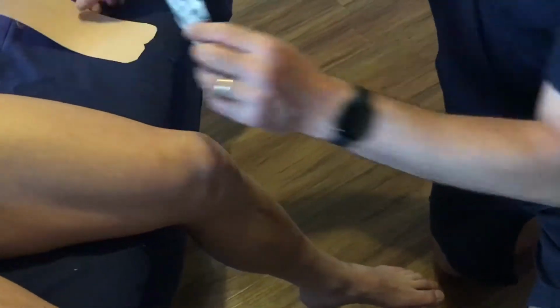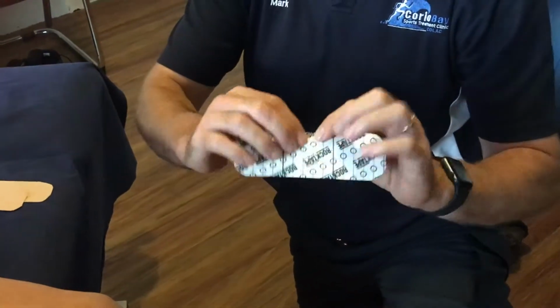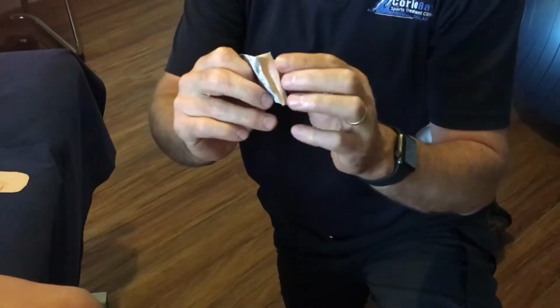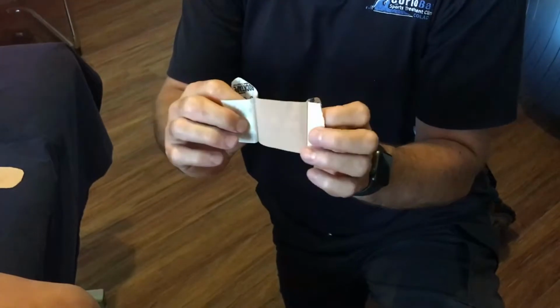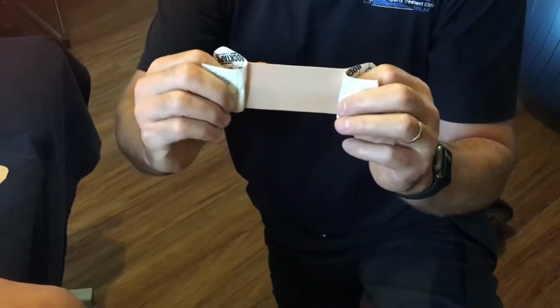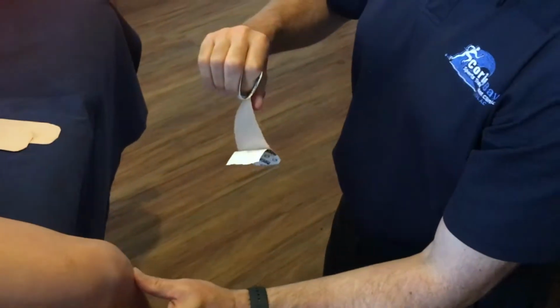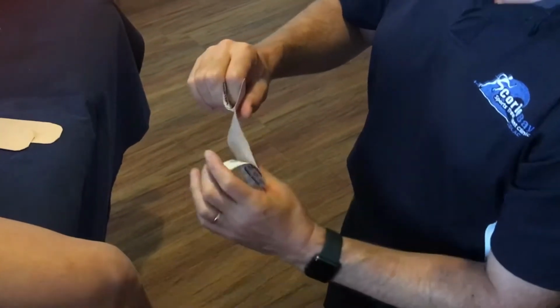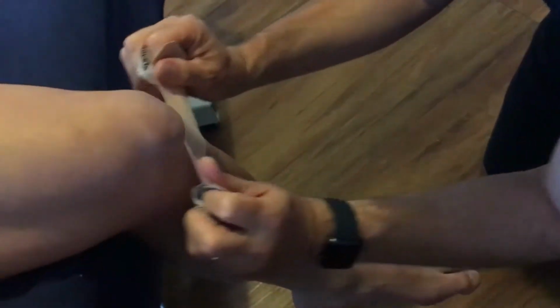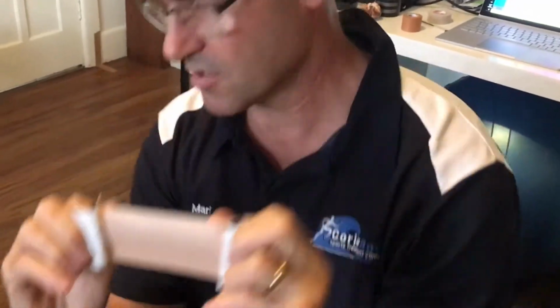So we take our short piece first, and it's the 15 centimetre one. We tear it in the centre, so it's got a tape backing. To get the paper off, we tear it in the middle, and then we fold it back and grab hold of it a bit like a band-aid, like a really big band-aid. But we have a couple of centimetres either end where the tape is still on, and we basically find the bottom of the kneecap, so the bottom of that bony bit there, and we lay the tape over the top, and we put a bit of stretch on it. So this it'll stretch. If that's 100%, we want to have about 50% stretch on the tape.